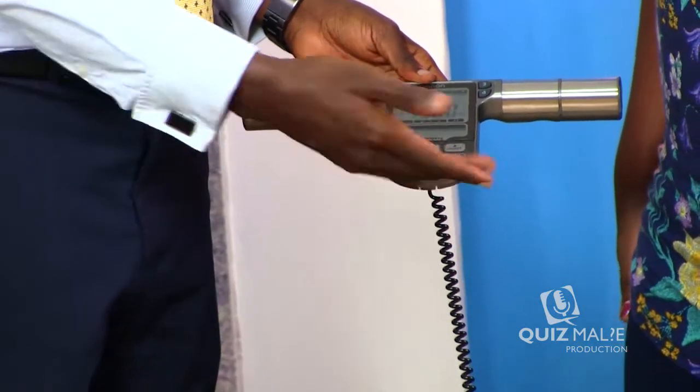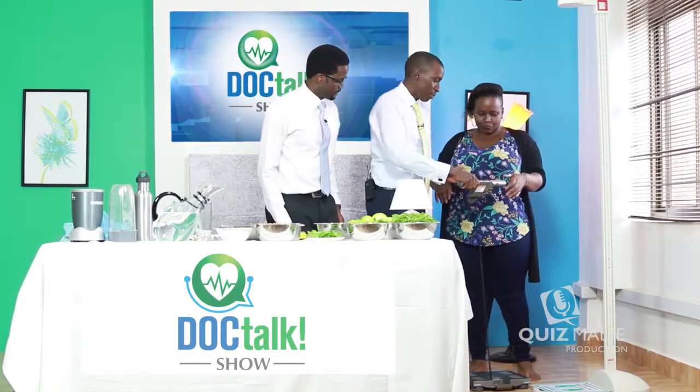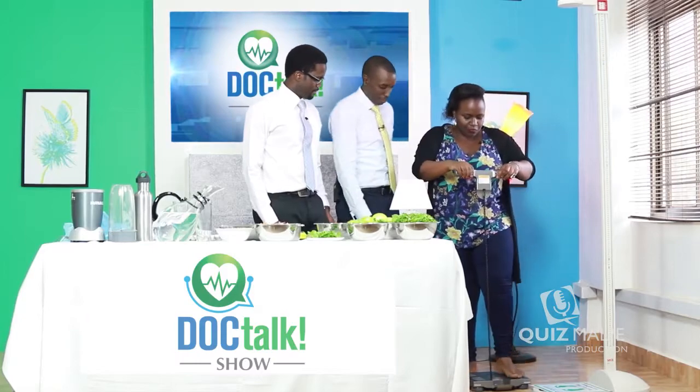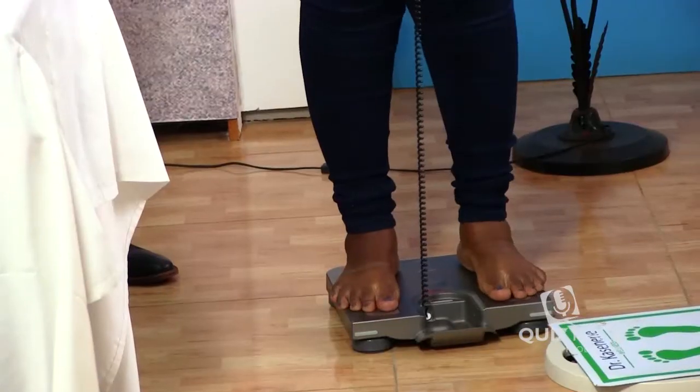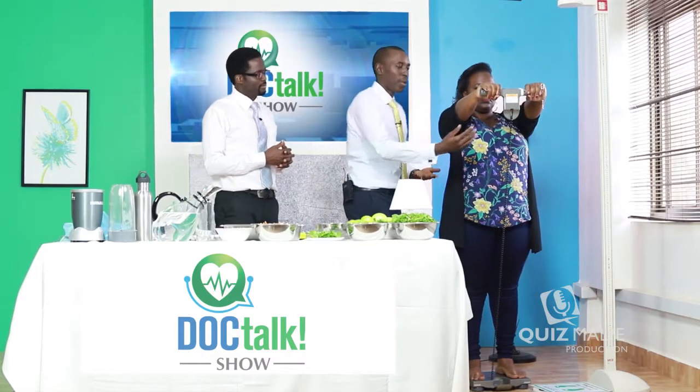So we're going to ask her to get on the scale, and it will then take us through the measurement. It's almost like a motorcycle, is it? So that it can actually measure all the different parameters. And now we are done.